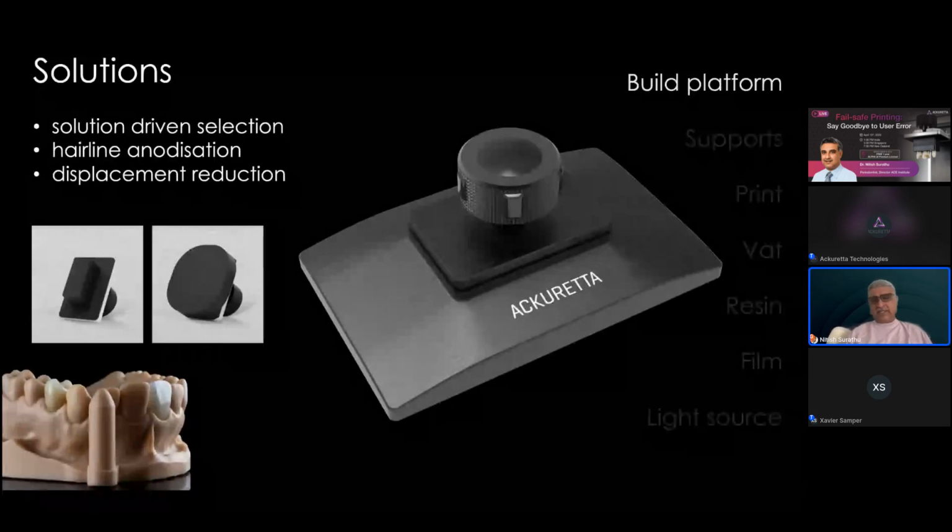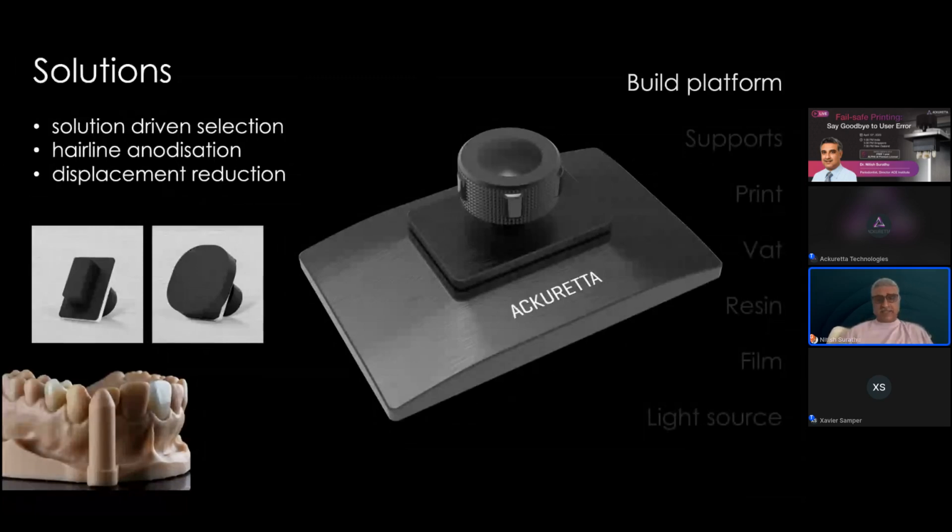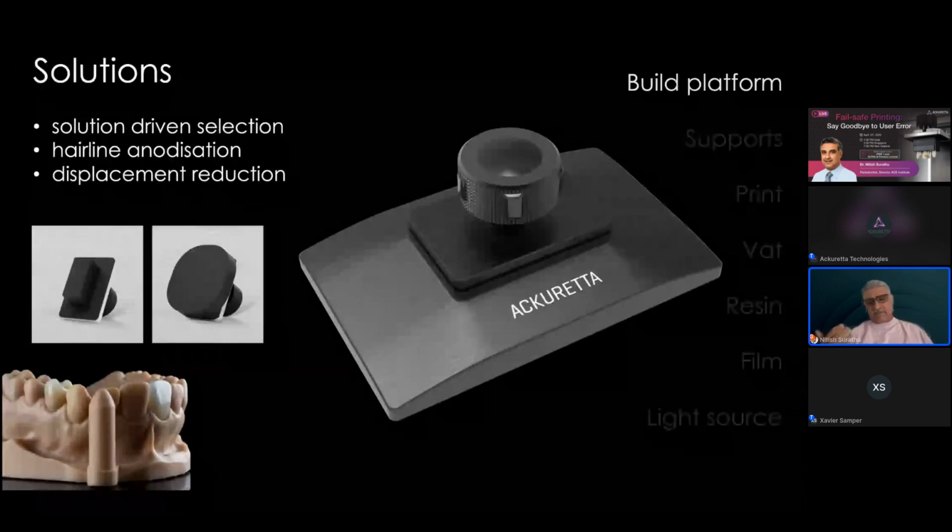And they're available in 3 sizes. Now, these sizes are really application driven, and we'll talk about that later in the presentation. But these platforms are available as large, medium, and small platforms, and they have purpose. You do get companies talking about the fact that you get reduced size platforms nowadays, and that these platforms are faster.